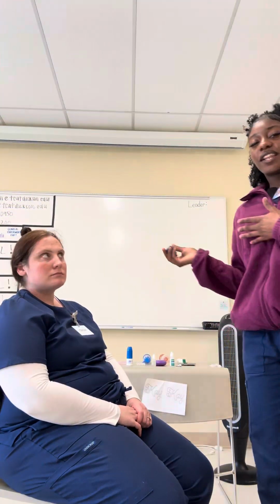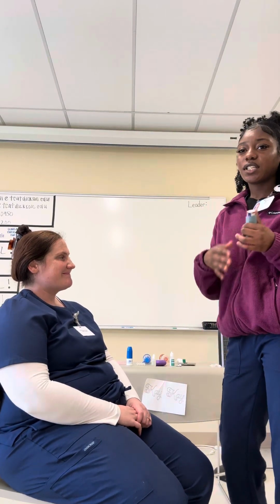So with the meter dose inhalers, again, you're gonna verify the provider's orders, make sure it's the correct inhaler, correct patient, perform hand hygiene, introduce yourself, two identifiers, and explain the procedure to your patient. And then before you get ready to administer, you're gonna shake it 5 to 6 times, and your patient should be able to administer themselves, but you would still need to give instructions if they're not too little.